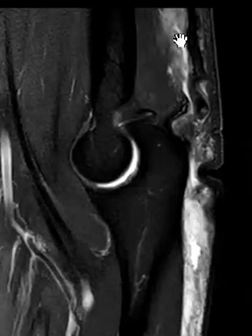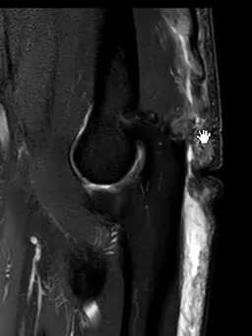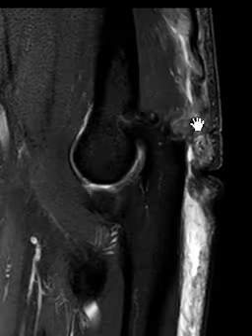And then again, this long central tendon from the long head and lateral head is superficial. We see it's torn and stripped away from the deep component. And again, there's also a transverse tear right near the attachment.